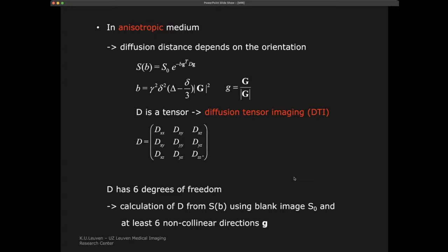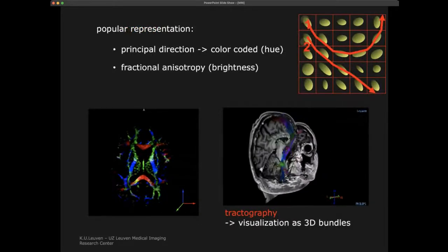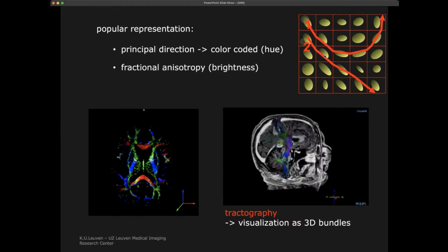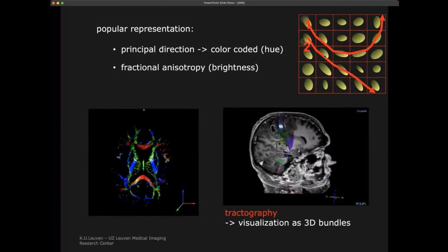So if we measure the diffusion in the different directions, we can actually measure a diffusion tensor, so all the different components of the diffusion vector. We can study local anisotropy: we measure anisotropy in diffusion and infer anisotropy in the local morphology. This is what we do when we do, for example, tractography or diffusion tensor imaging in the brain. Locally in every voxel, we measure the dominant direction of diffusion, which would be the local fiber direction.